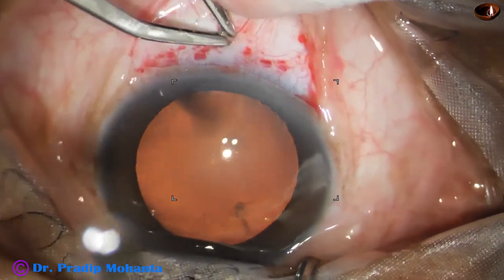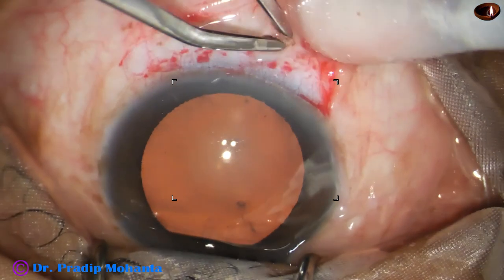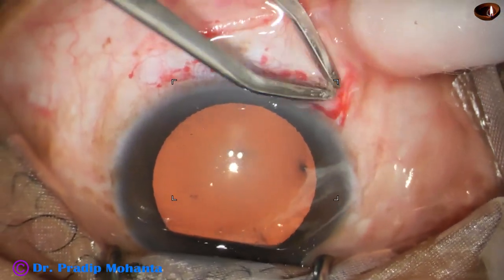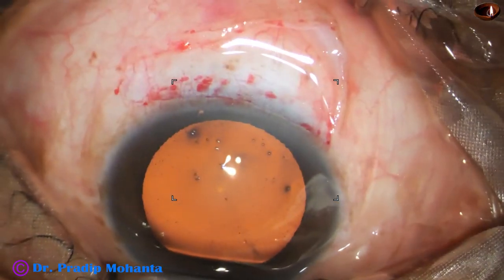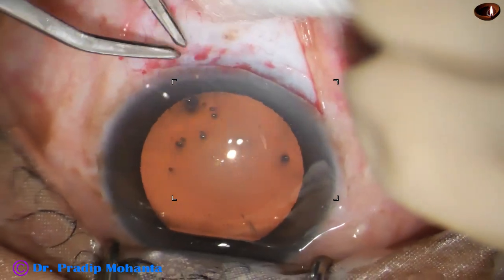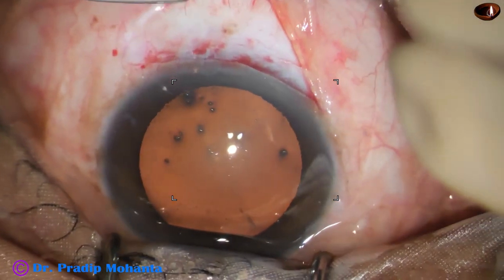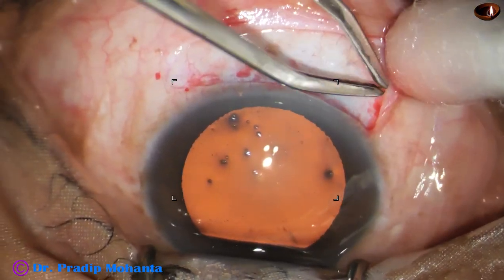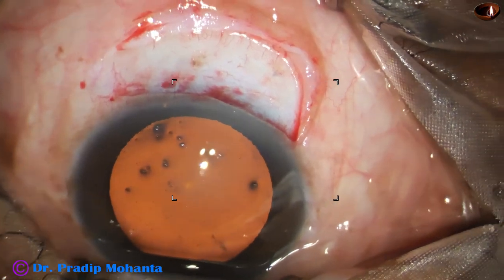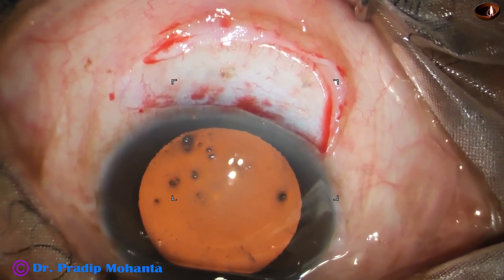This is a SICS with superior approach — we can do temporal SICS also. Very mild wet-field cautery is done. The conjunctiva is protected, and the conjunctiva must not be touched by the cautery prongs.